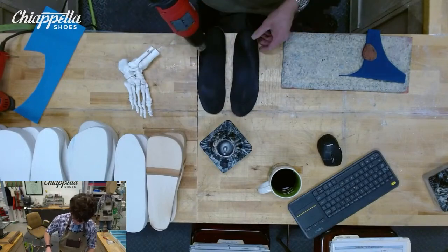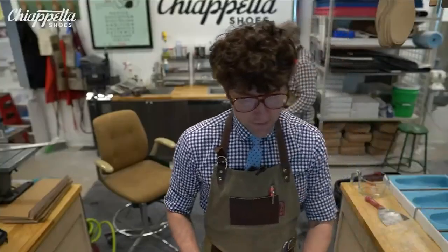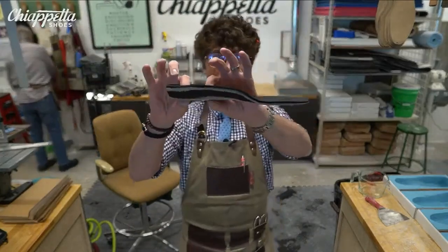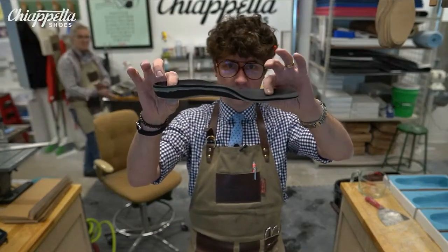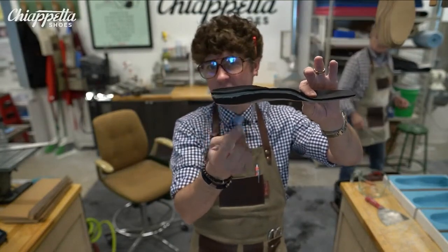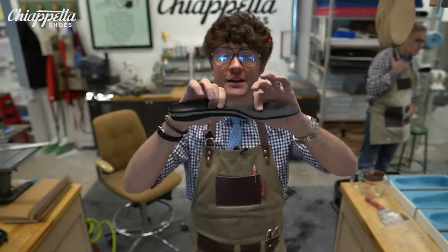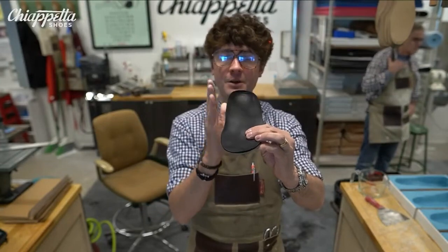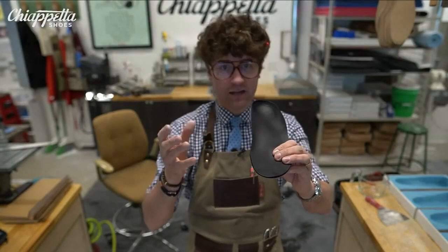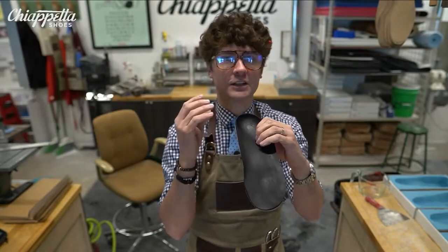There are three main variables when you're making an orthotic. You have the overall thickness here. So the thickness from the top layers and considering the heel, typically you're at about a 0.5 millimeter extra at the heel just because of how the tapering is. Thickness, wall height, how much it's coming up against the side. You only have so much space because you don't want to take up too much area inside of the shoe. The shoe is offering the wall stability. This is there for a little extra cupping.